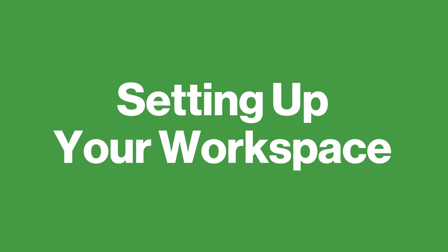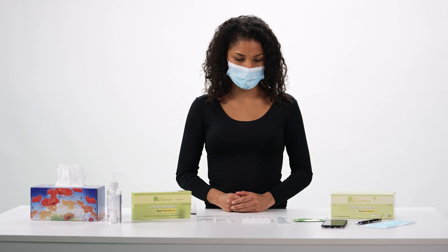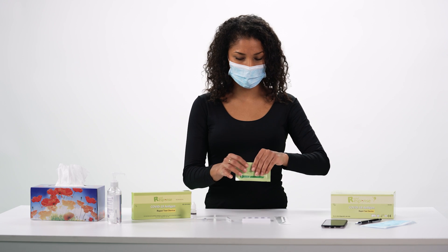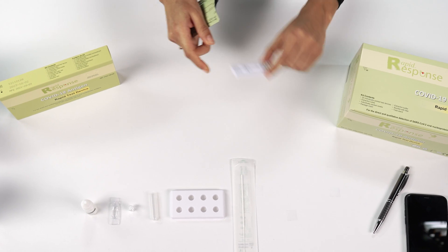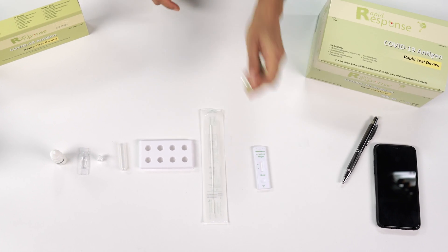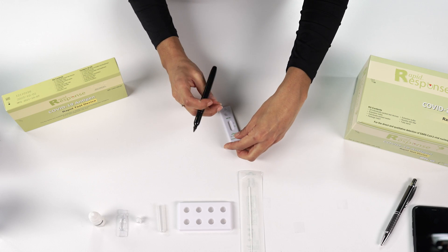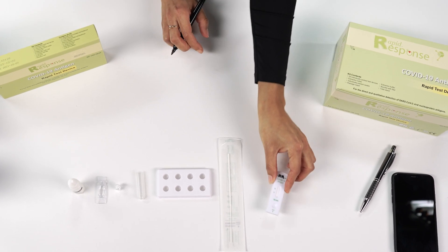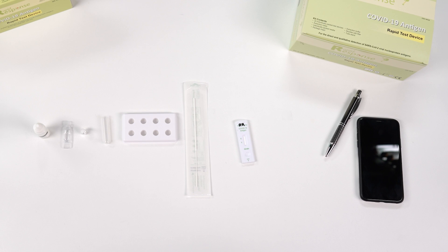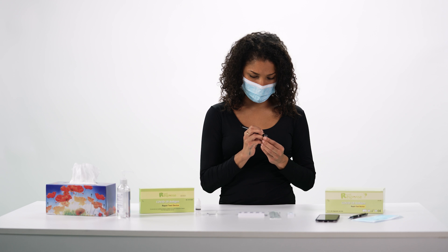Bring all the test materials to room temperature and wash or sanitize your hands before beginning the test. Begin by opening the pouch and removing the test device. Place the device on a clean, level surface. Use a permanent marker to label it with your initials or the initials of the person who is being tested. Label one extraction tube in the same way and place it upright in the tube stand.